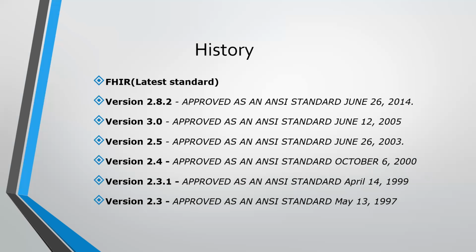Most of them ask me whether 3.0 is a good success, or why people are not moving to 3.0. Even as of today, the standard that various hospitals or various countries are using is 2.x. They don't touch 3.0.